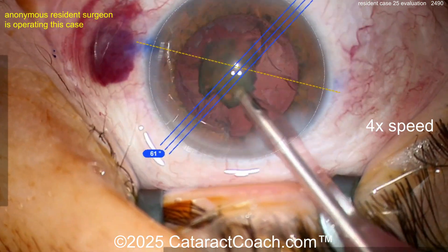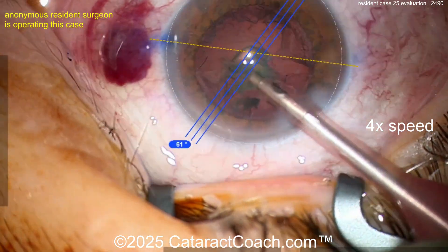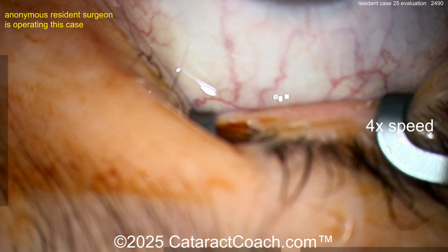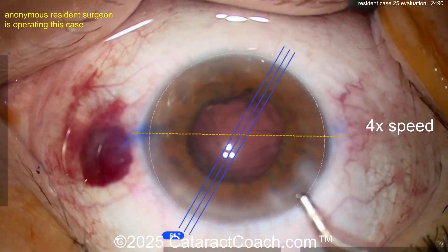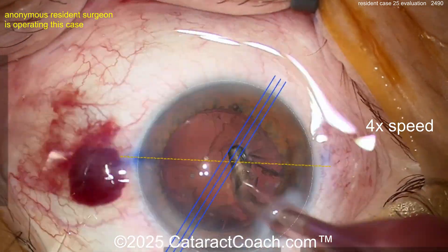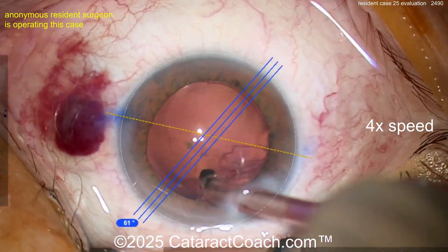I'd love to protect the capsular bag with my second hand. Now, you're at the mercy of your attendings and professors. If your professor tells you to do it their way, then do it that way. When you're a young trainee, do it the way you're taught by your faculty. Each faculty member may teach you differently, and then finally, once you've got enough experience, decide what you want to do your own way — amalgamate the experience, change it up, do whatever is best for you.